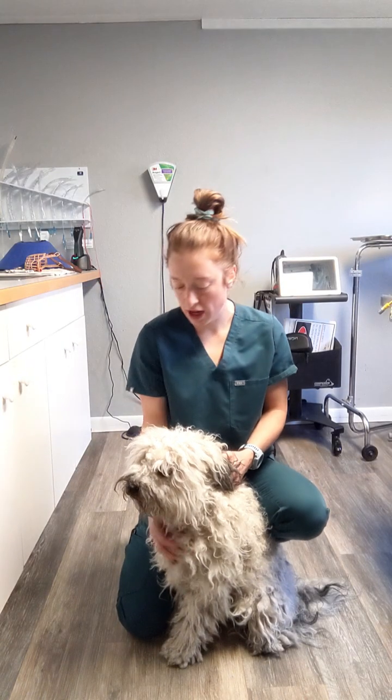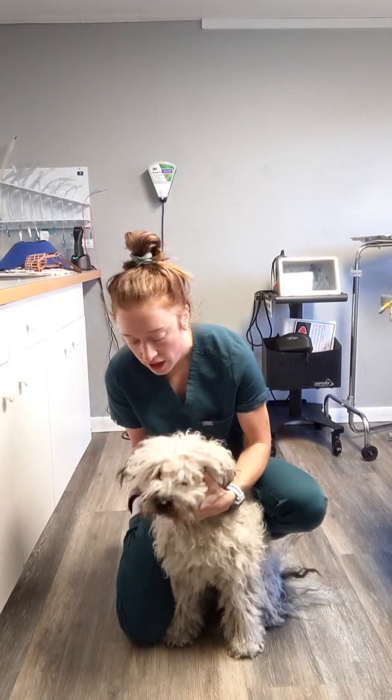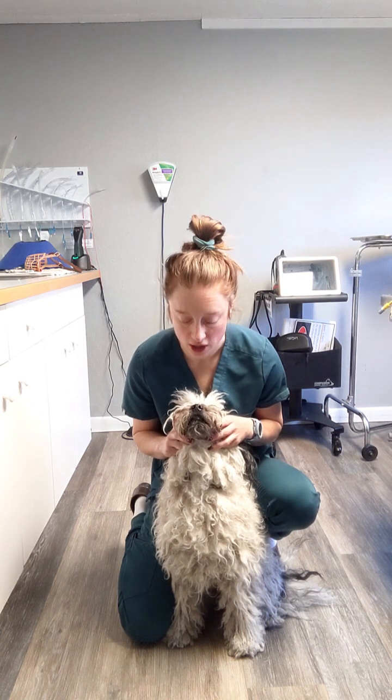So for a jugular blood draw, if I were restraining, I would hold the patient in a sitting position with the back facing me, making sure she's close to my body so she can't wiggle around. I can kind of brace her with my legs. I'm going to put either hand on either side of her head, and then I'm just going to lift her chin up and help the neck be exposed, and then the tech would come in for a jugular blood draw.